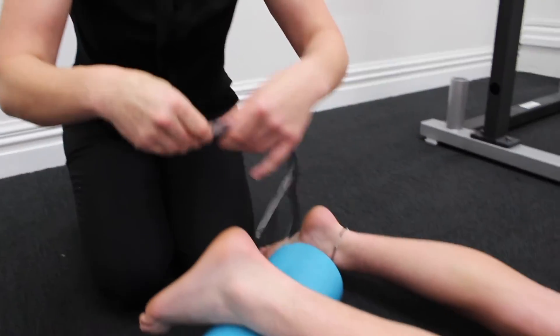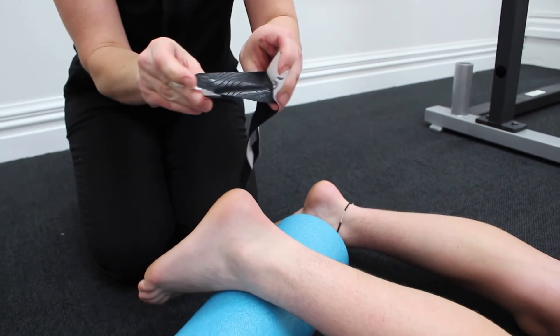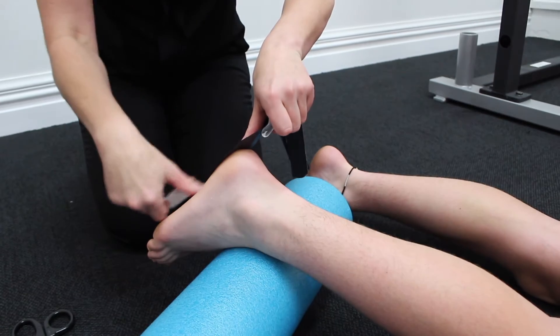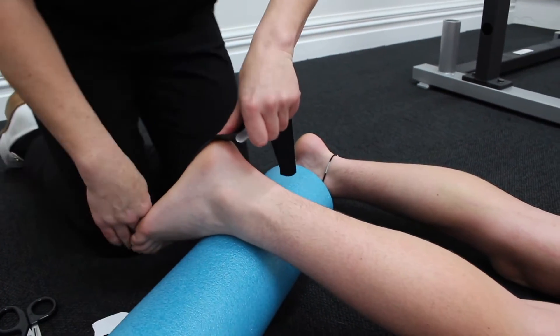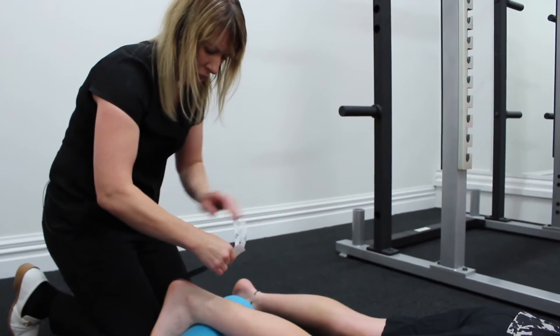We're going to start under his heel, so I'm going to rip the tape, fold the paper back without touching the underside of the tape, put it under his heel, and use my knee to push his toes up.